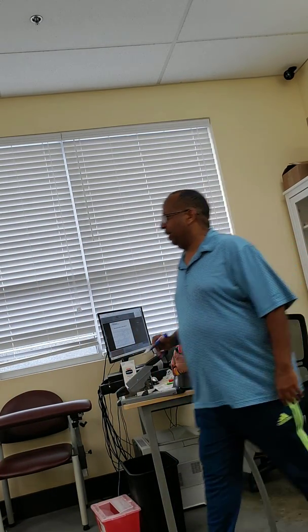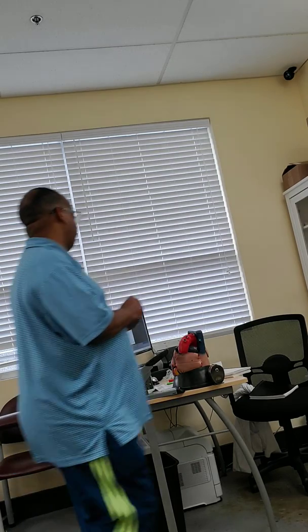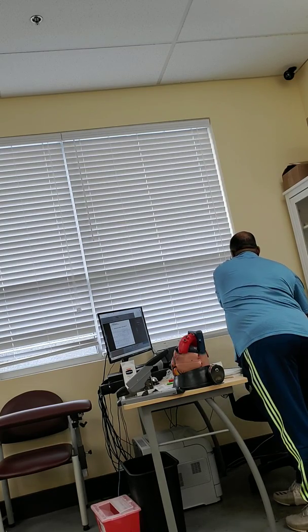When we do between R and R, that is called ventricular. When I say R to R, they are not regular. That means the ventricular rhythm is irregular. When I do P and P, between this P and the next P, it is irregular. It means that's the atrial rhythm. So that's why we have two kinds, ventricular and atrial. RR depicts ventricular, and PP depicts atrial.